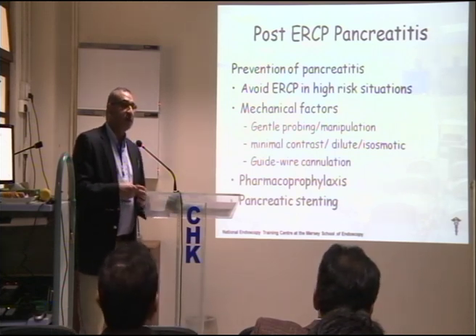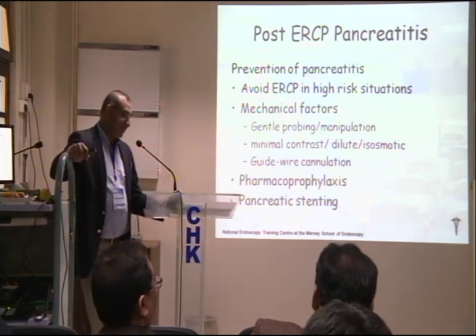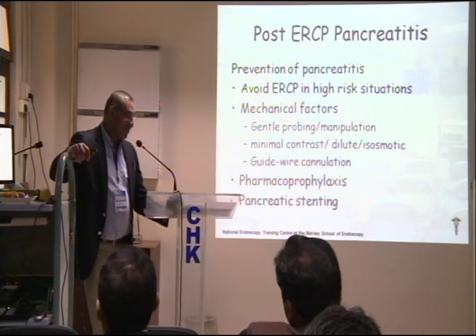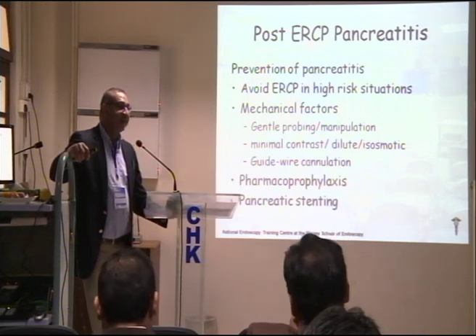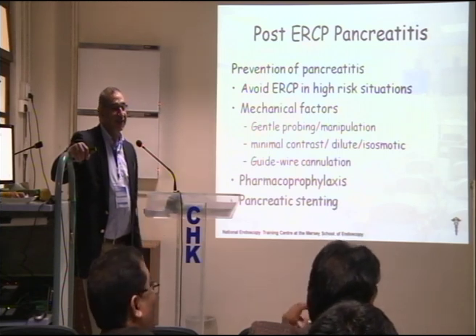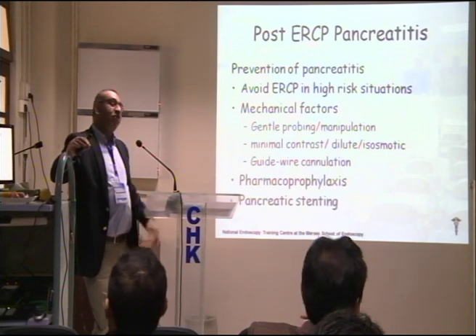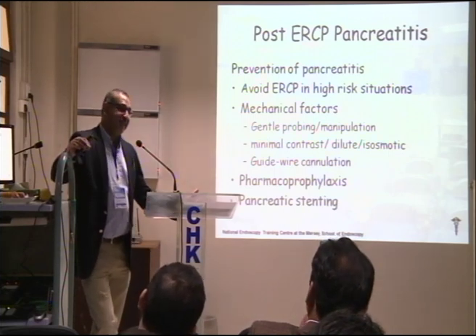Oh, minimum, there is no minimum. Normally, it depends. So you're saying if you go into the pancreatic duct 3 times, you should put a stent in? I think I would strongly discourage you to do that because you are adding on another complication then.